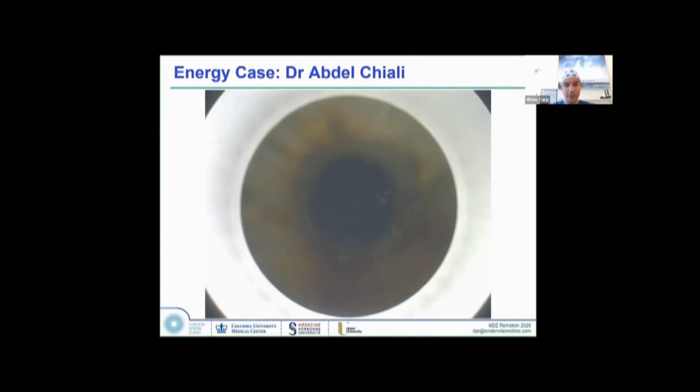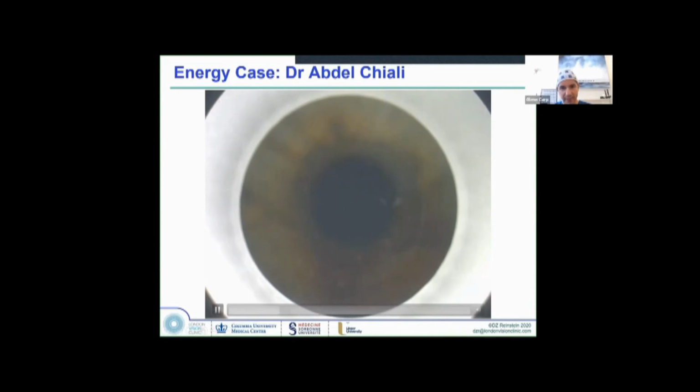It's practically no bubbles, hardly anything. You can see a few little bubbles over here. You're going to see the side cuts of the lenticle, just about, because the bubbles are one on top of each other. Now we're seeing the cap cut. That's the full bubble pattern of the cap cut. And then finally, you're going to see the little excision on the side, because again, the bubbles are stacked up on top of each other.